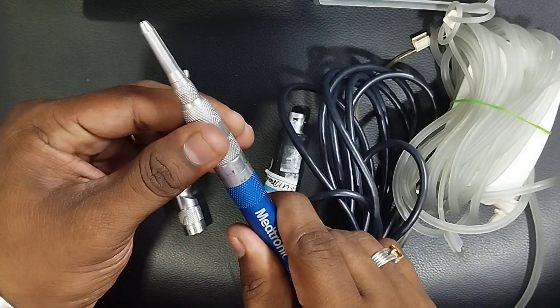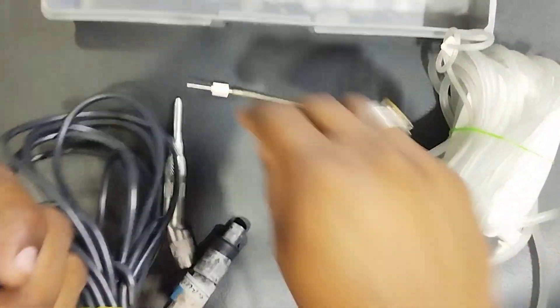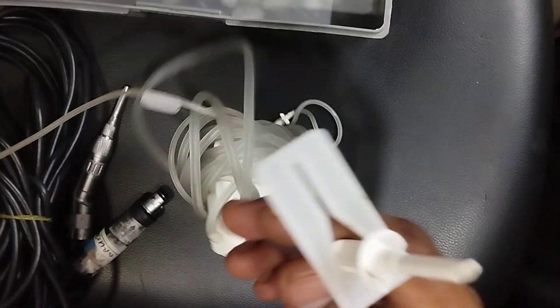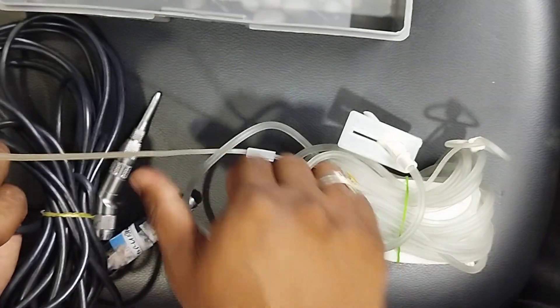First, connect this attachment and just lock it. This is the state attachment. Once it's locked, I'm going to put the tube in. The tube has two ends: one end connects to the IV stand, and the other end — the pump area — connects to the pump.